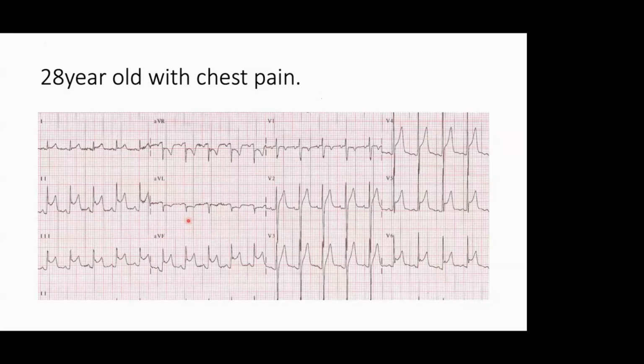I think you are following. Hello? I can hear you. It's a pericarditis ECG.